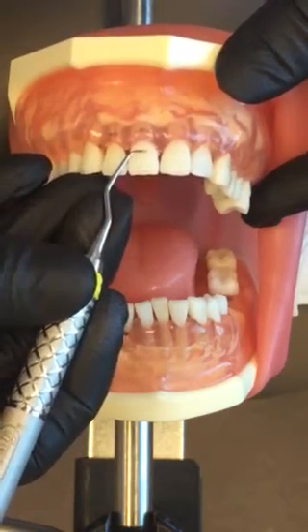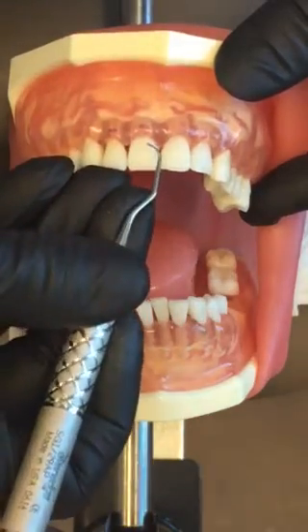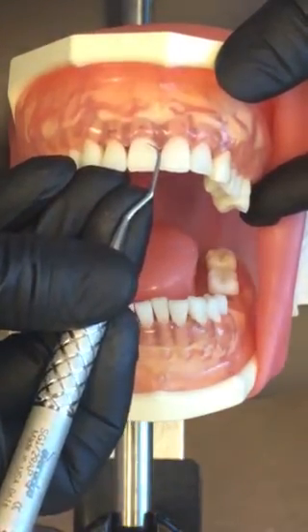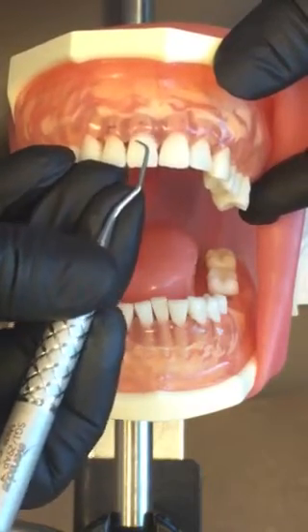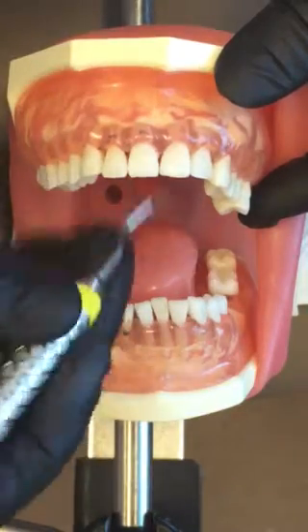If you choose the incorrect working end, when you're looking under the light sitting at 12 o'clock, you'll be able to tell that the face is open and there's no blade engaged when you start scaling. It's really hard to tell that on the video.